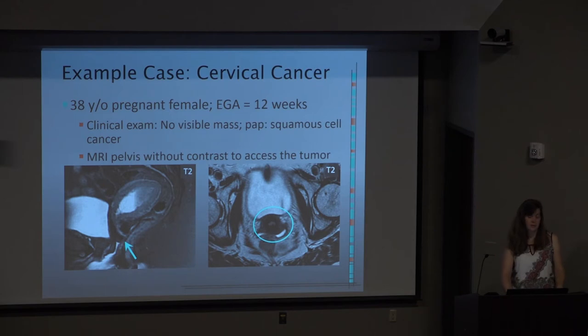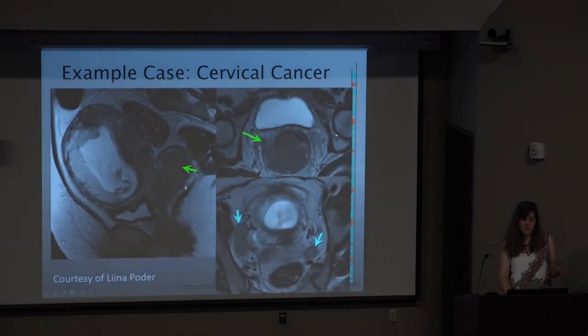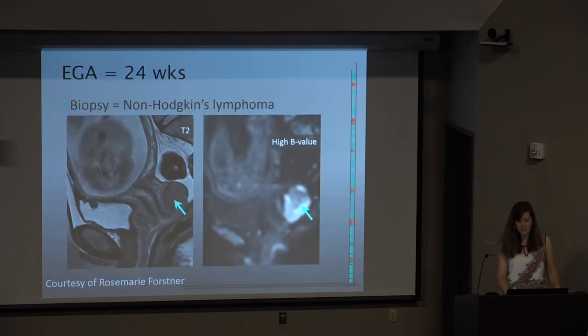And I think it's really hard to counsel patients on what to do in these cases. Sometimes you know what to do because it's way more obvious. So like in this patient, she's 16 weeks along. They actually saw a mass. We saw a mass. So this is a larger uterus because she's farther along. And then instead of a black cervix, you kind of see this light gray stuff here. And axially, you see a little normal black cervix here, but all this gray tissue is tumor. It's out into the parametrium, and she has some nodes. So this is a completely different conversation with the patient. More unfortunate, I think, but at least you know there isn't really kind of an option waiting with this one.